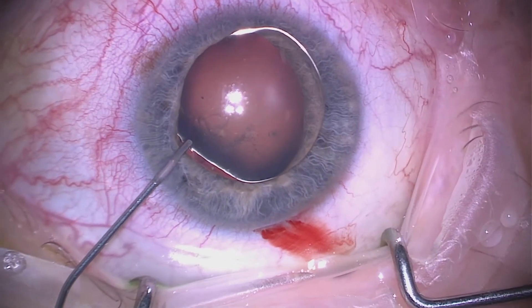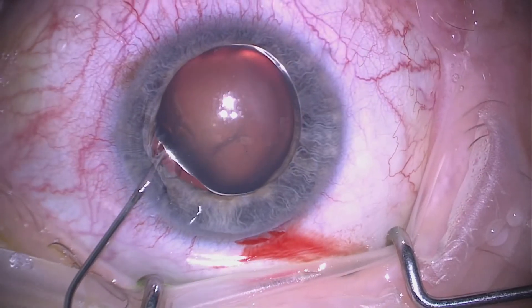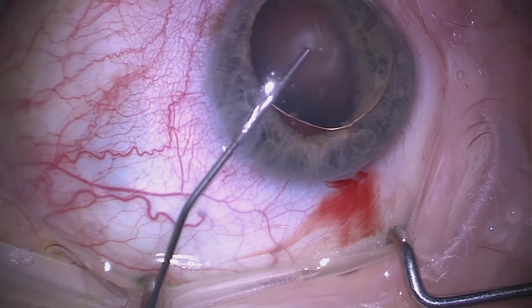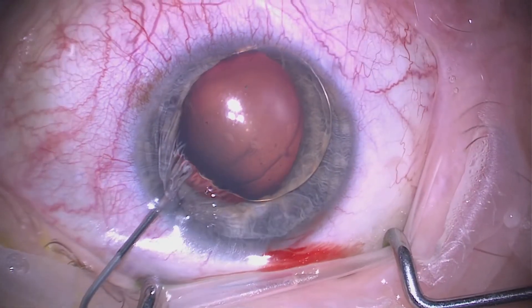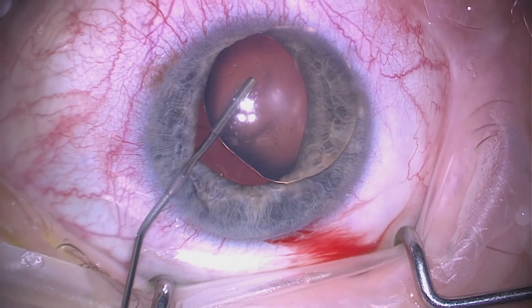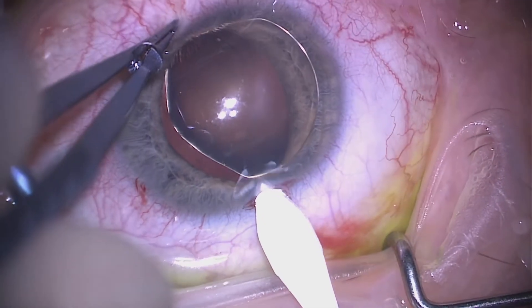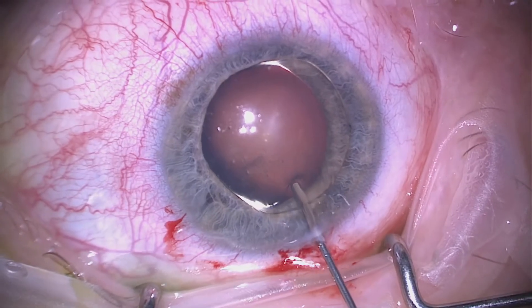We are placing some viscoelastic here — this is dispersive viscoelastic in the form of Viscoat — behind this dislocated lens to really compartmentalize and push the anterior hyaloid face back so that we have room to work here in the anterior chamber. We then go ahead and make our main incision using a keratome.